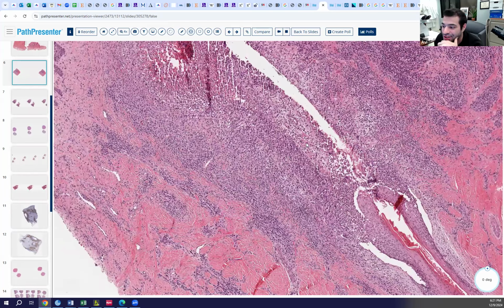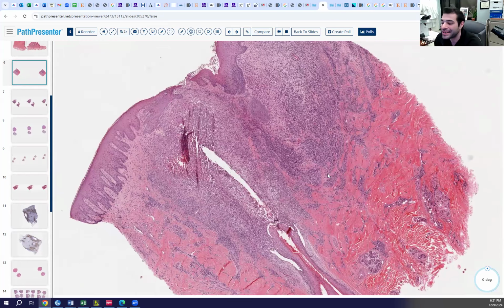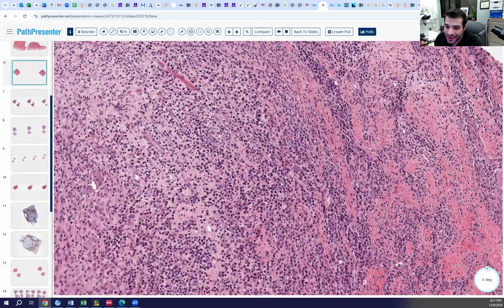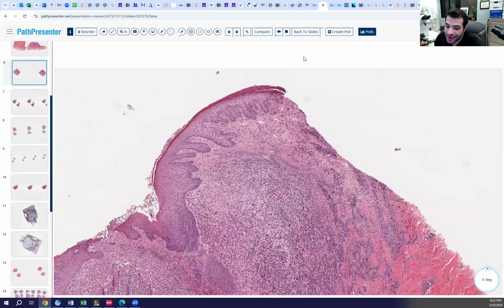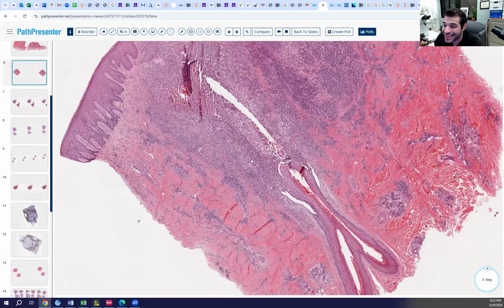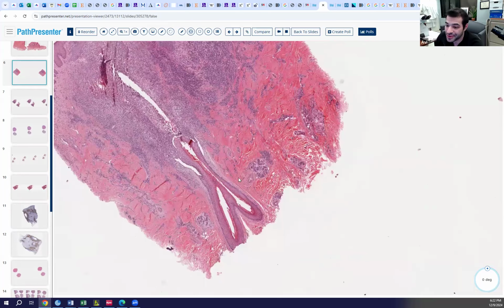And by the way, is the inflammation more top of the follicle heavy or bottom of the follicle heavy? Top of the follicle. Yeah, so infundibulum, isthmus, not as much in the bulb. There's also some acanthosis of the epidermis, which has also been described. So what gives you all of that? What gives you rupture of the hair follicles, a large neutrophilic infiltrate, plasmacytic infiltrate, with not just perifollicular fibrosis but interfollicular fibrosis, and all the other features of scarring alopecia as well? You'll notice there's no sebaceous glands here as well.